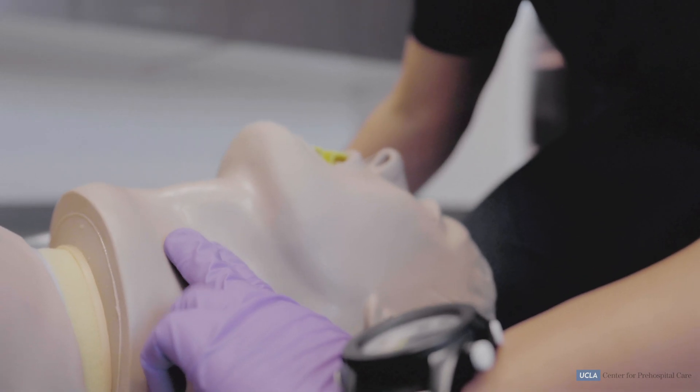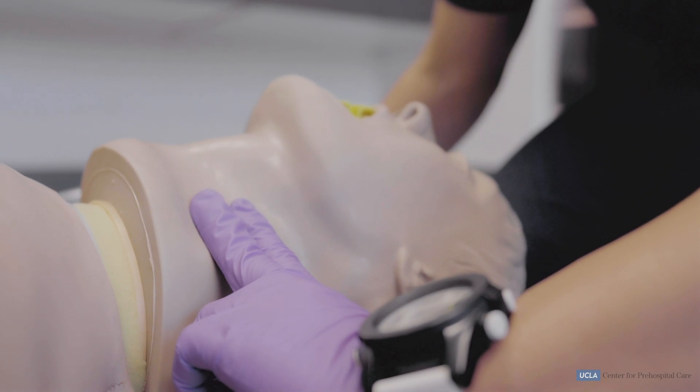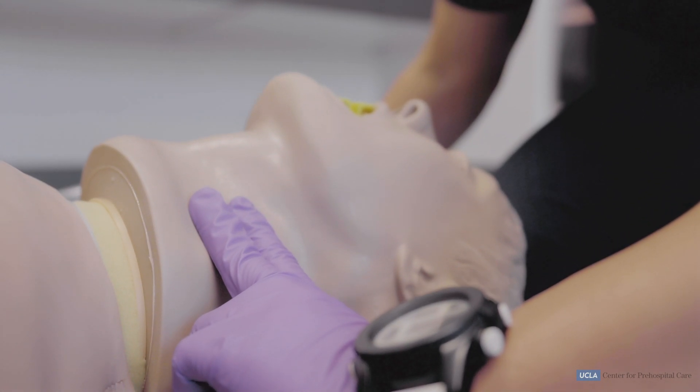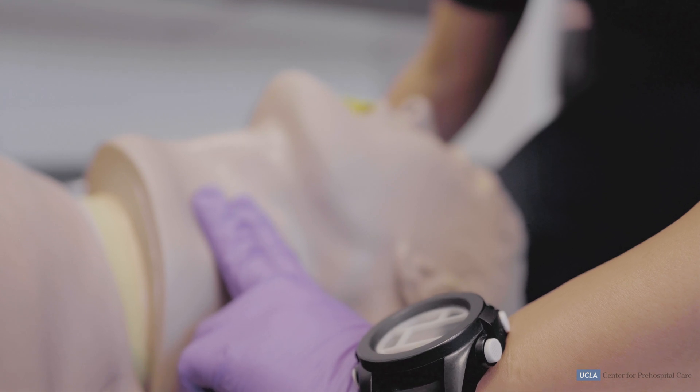She reassesses pulse every two minutes. If no pulse is present, initiate cardiopulmonary resuscitation.